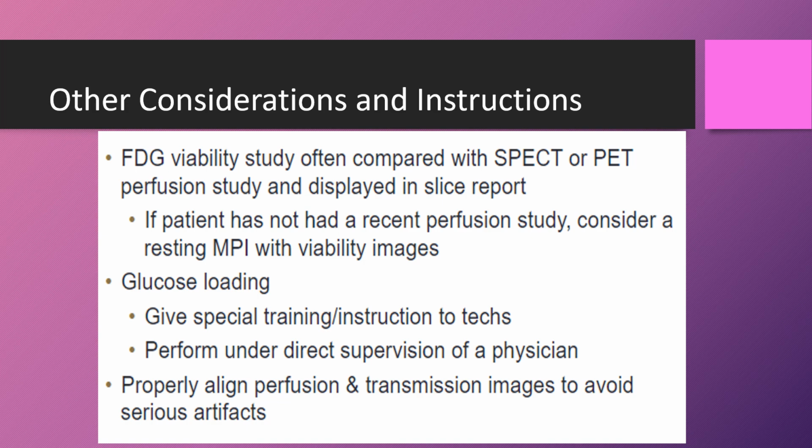You want to properly align the perfusion and transmission images to avoid any serious artifacts. If you have misaligned data between the perfusion and the viability, or the perfusion and the CT images, then that will create perfusion artifacts on the images.